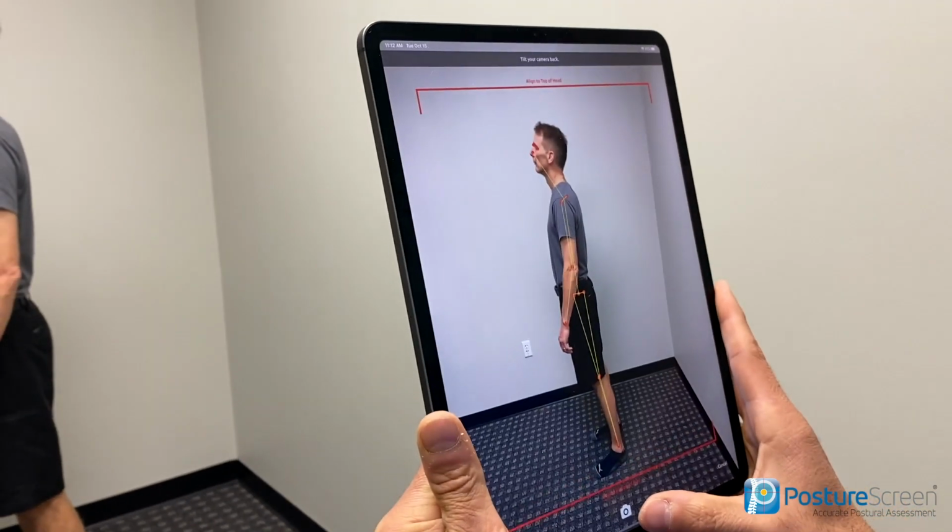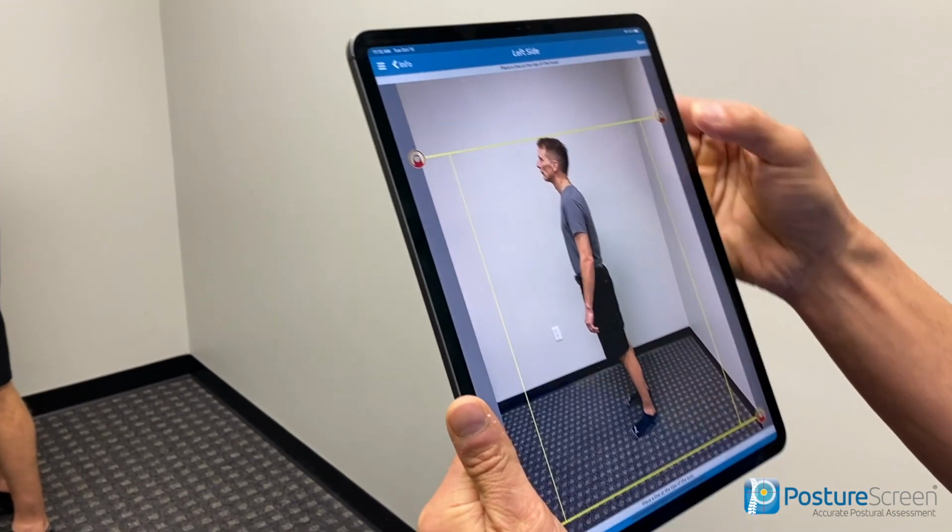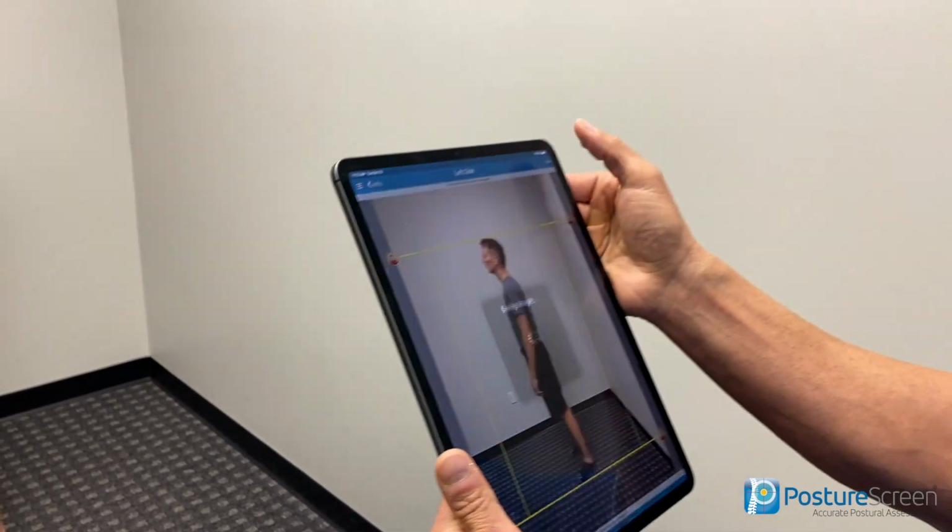Now, I have the advanced features turned on for this, for the 4-view. You can turn those on or off. Now, some of you may be asking, what are the advanced features, Dr. Joe? Well, good question. So I'm gonna answer that for you. In the 4-view, you can turn on thoracic kyphosis, ASIS to PSIS angulation. You can turn on the ankle pronation supination, as well as Q angles also calculated and turned on. If you don't have those measurements in your 4-view, we have a video on how to turn those features on. They're off currently by default.